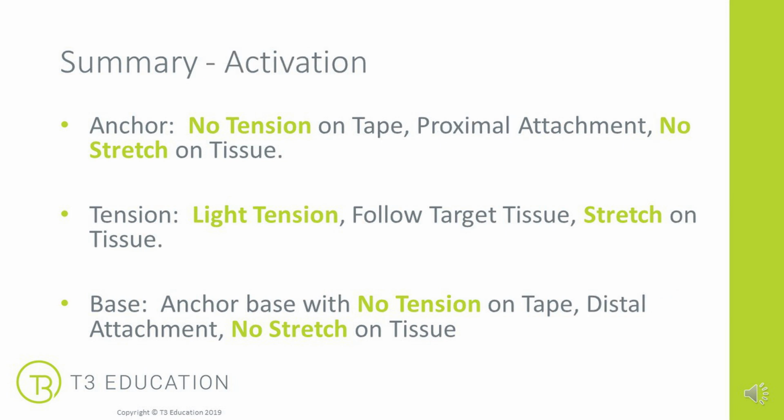For activation, the process is almost identical. You just need to note here that you're starting proximal, so towards the midline of the body, and finishing distal. Same process, same steps, simply a change in direction.